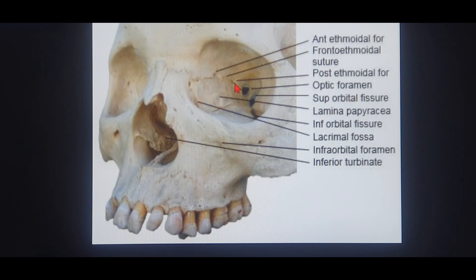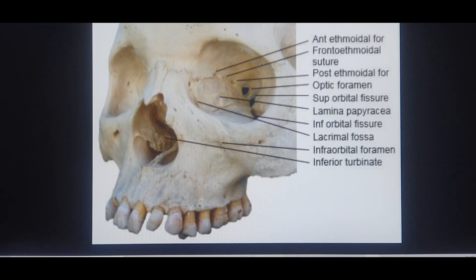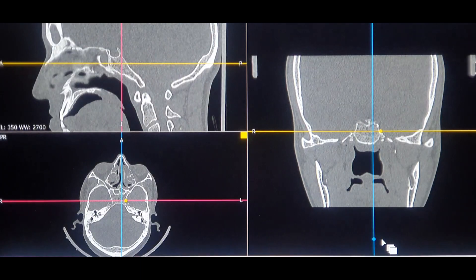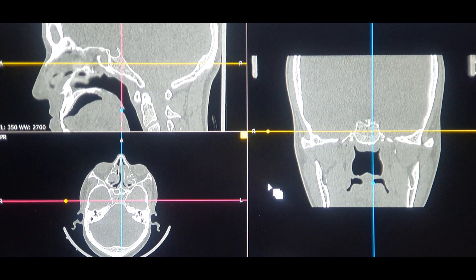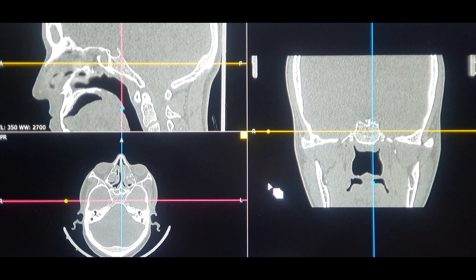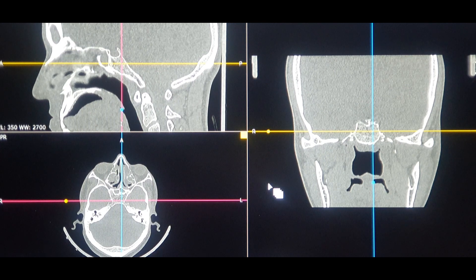That is how the measurements are done on basic bony anatomy. Showing the same thing on the radiological aspect makes it easy for ENT surgeons, skull base surgeons, and radiologists to pinpoint any pathological condition or variation in the Rule of 24, 12, and 6. The common mistake young surgeons make is thinking 6 mm comes from the anterior aspect — it does not. It is from the posterior aspect. Remember: 6 is for the sphenoid, where we see the optic nerve.